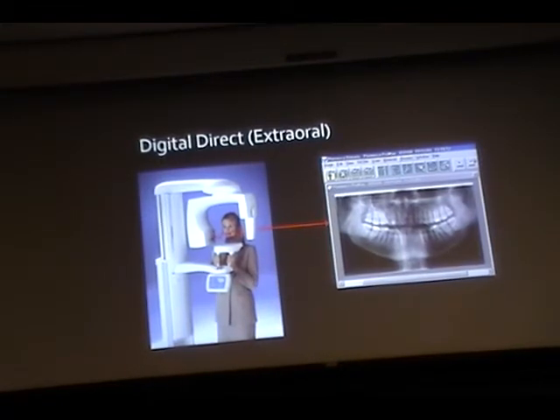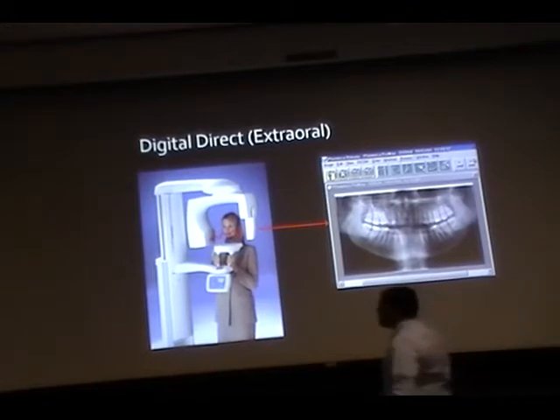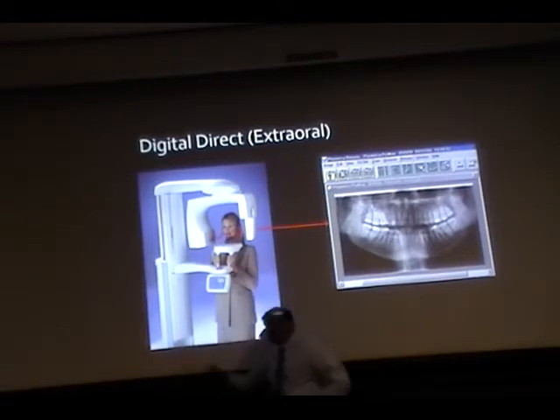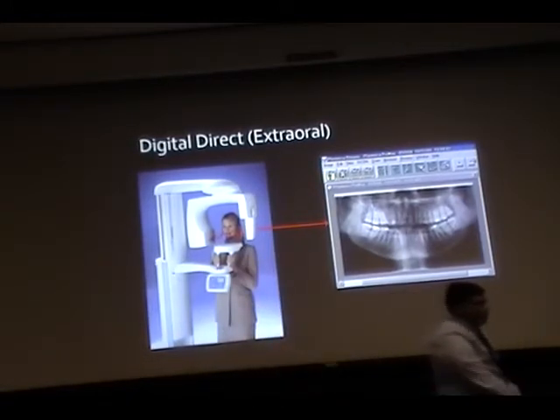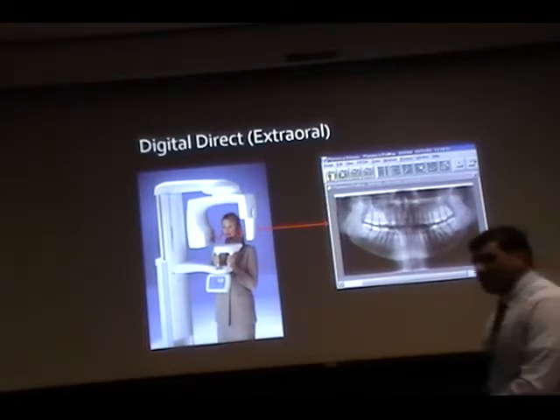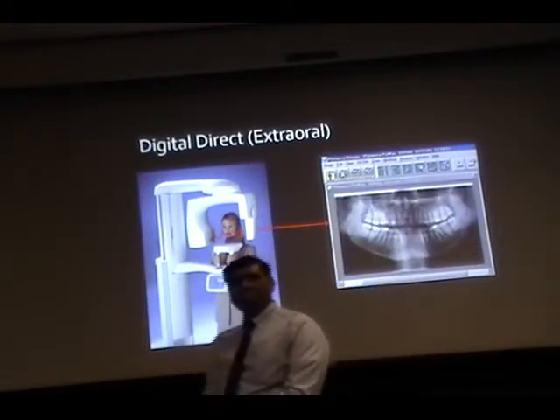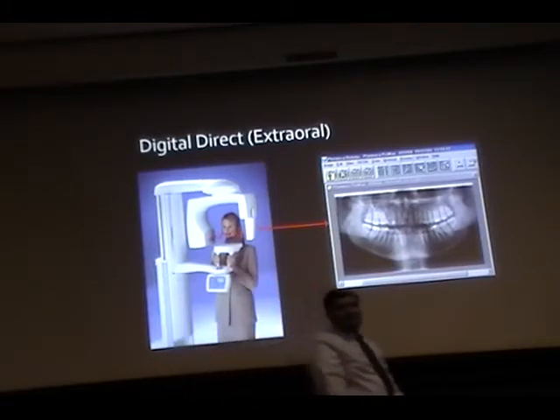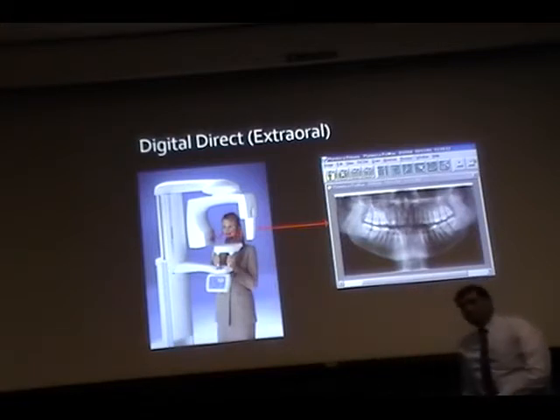So you may have seen this particular image, right? If you look at this, the X-rays are coming and hitting the sensor. How many of you have dental offices, or your mom, dad or some relative has a dental office with a CBCT machine?